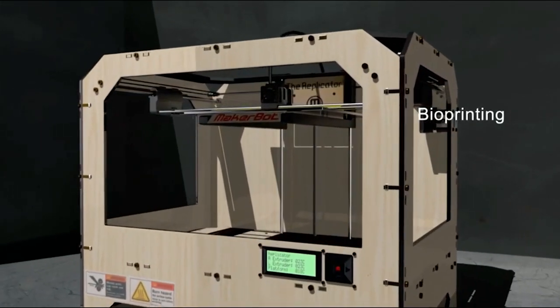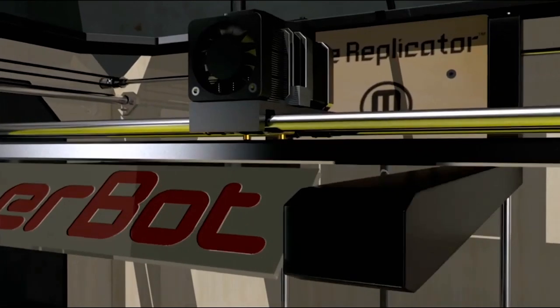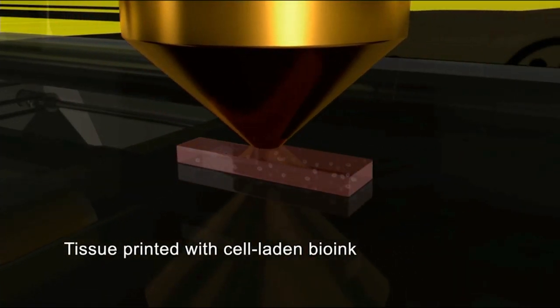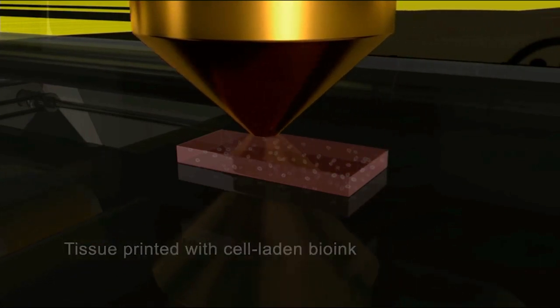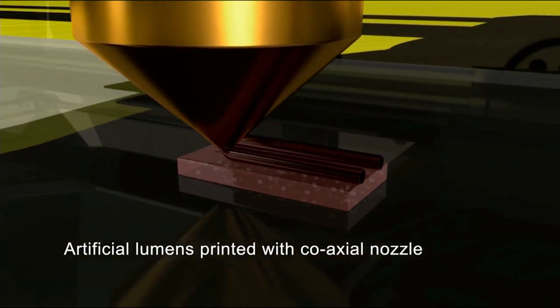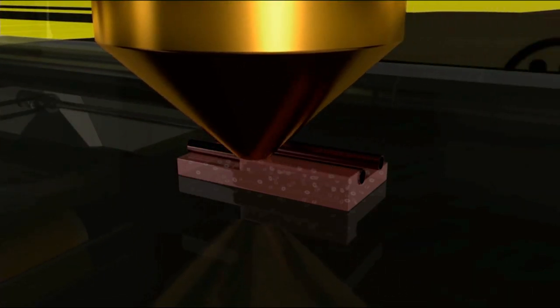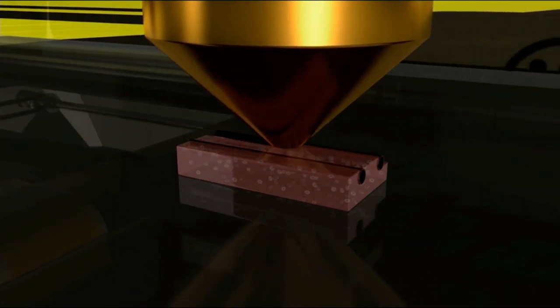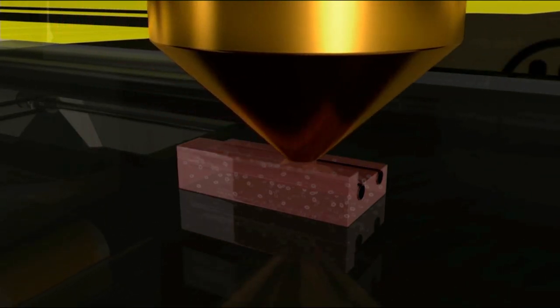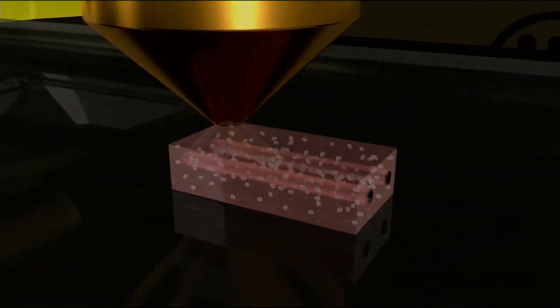So I have a quick video to show how this process works. So I use a 3D printer that initially lays down the bio-ink and has the cells in a kind of random configuration. I then print tubes, and I'm printing these tubes because this is going to be how I feed the cells with media. And the media is simply kind of like Gatorade. It's got a bunch of proteins and sugars that the cells enjoy. And then I encase it all with more bio-ink that has the little cells.